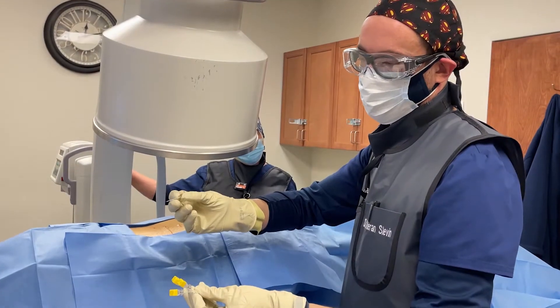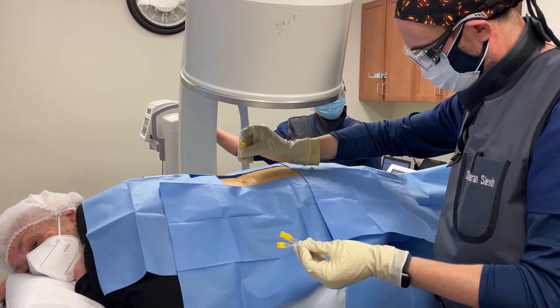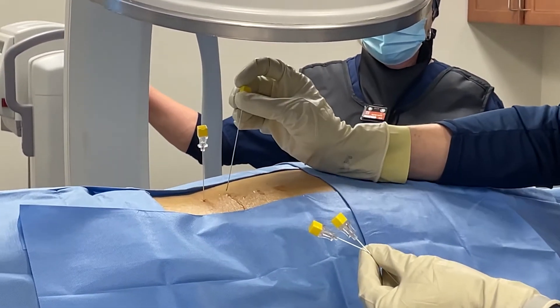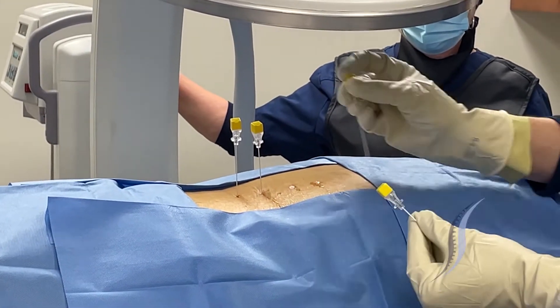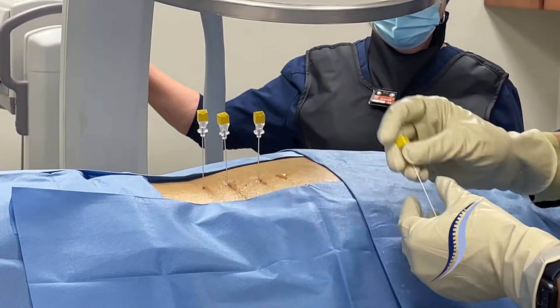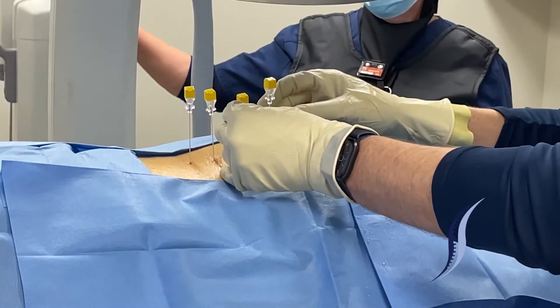The direction to which the needle bevel is bent towards is important to remember. The needles are positioned following the angle of the fluoroscope — the angle of the beam, I should say.